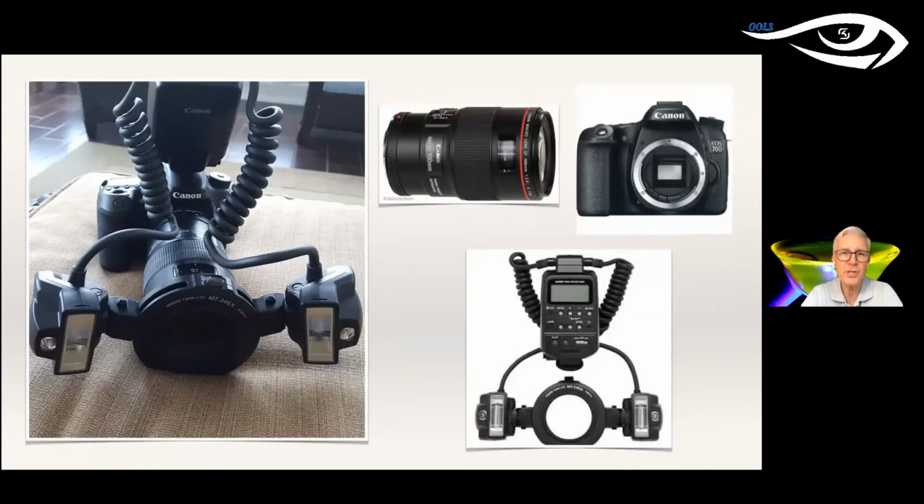So a lot of the pictures that we're going to see here in a minute, and the pictures on the magazines, which we started off with, I've taken with this camera. This is a Canon 70D body, which is really an entry level. This is not super expensive. This whole unit that you see here would be about $2,800 US. So it is important to have a flash with this. You really need to put a lot of light on your subject, and that's what you see here.